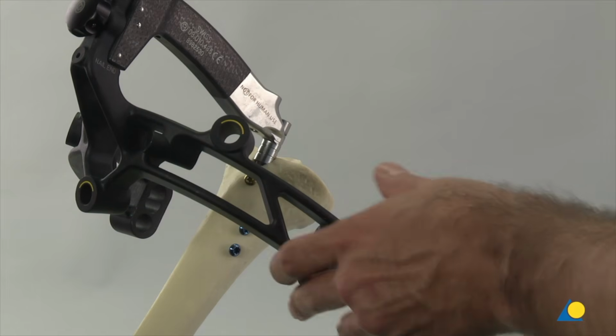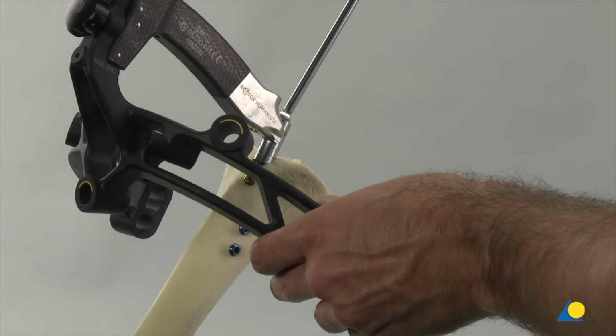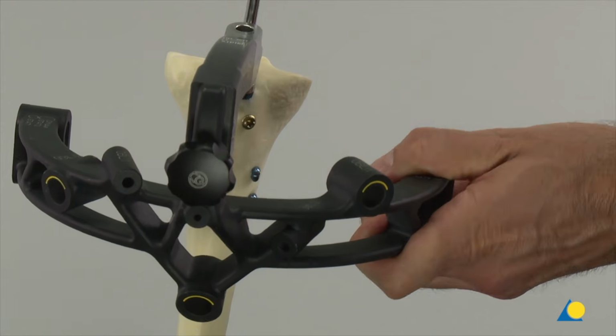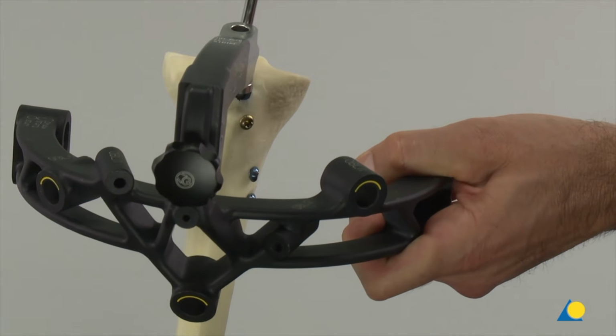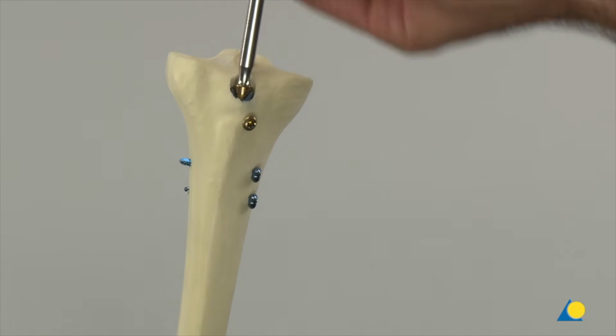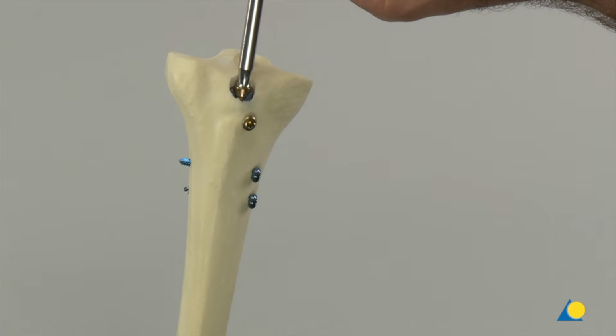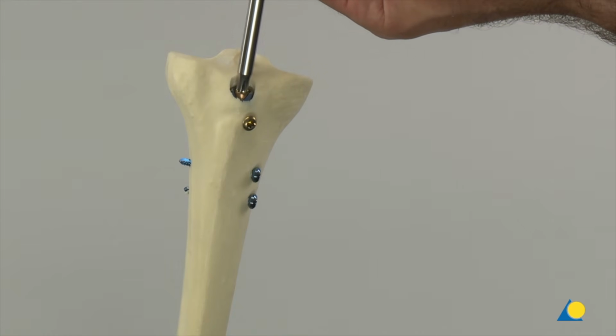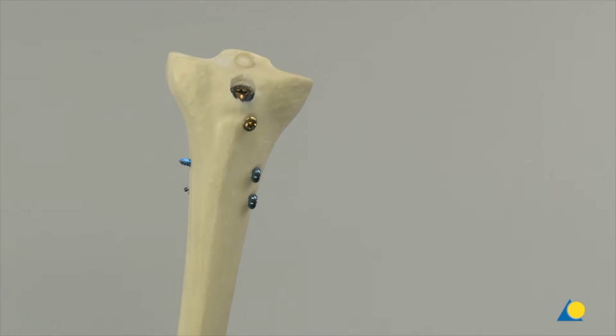The screwdriver, hexagonal, 8.0 mm diameter, with spherical head and T-handle, is used to loosen the connecting screw so that it can be removed together with the insertion handle and the aiming arm. To prevent cross-threading, the end cap is inserted in line with the nail axis. A counterclockwise turn can be used to thread it in the nail before clockwise turns are used to advance it and secure it.